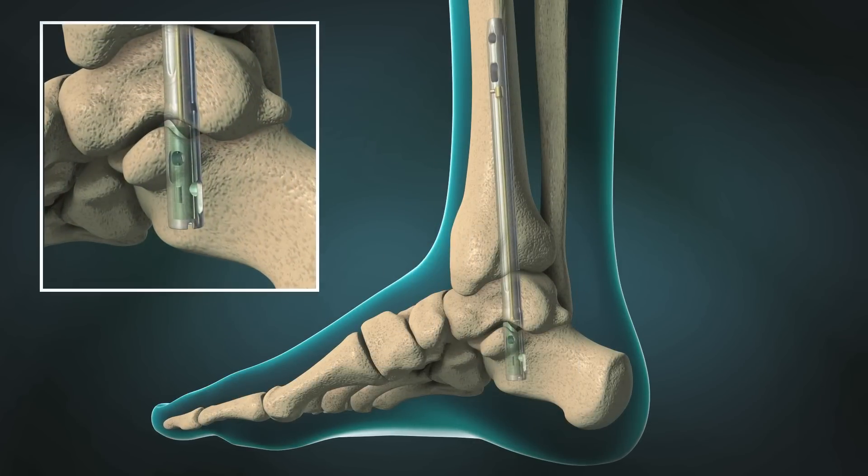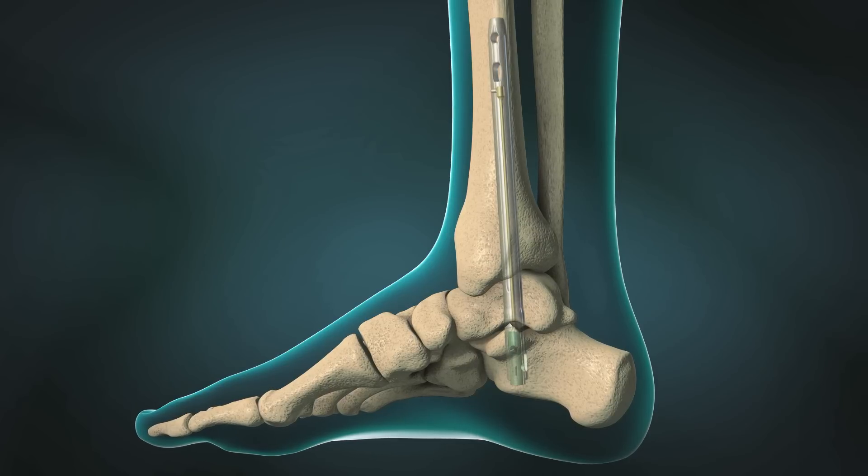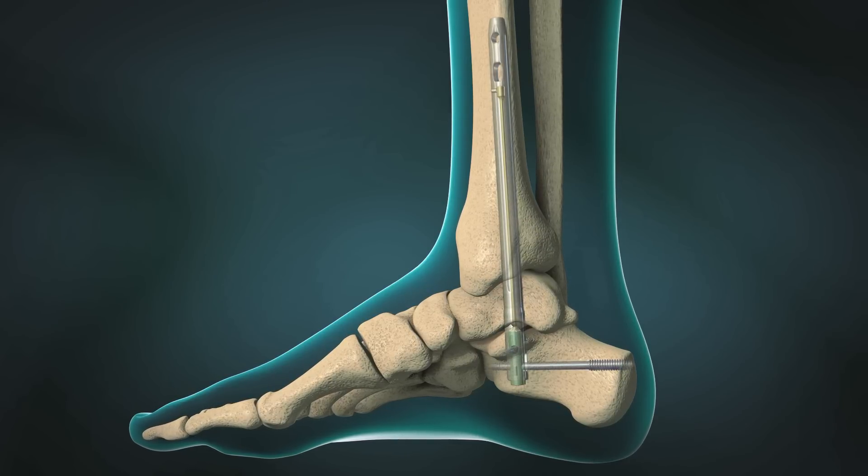Upon insertion, the internal element is stretched using the DynaNail targeting frame and fixed by screws in the calcaneus and tibia.